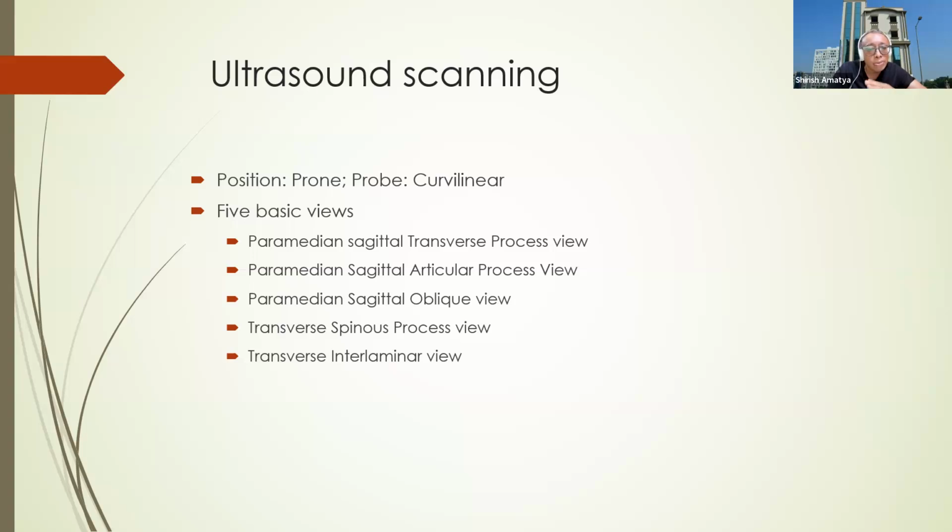In this paramedian sagittal oblique view, we can nicely see the anterior dural complex, the posterior dural complex, and we can also give epidural injection in this view. And 2 other views are transverse spinous process view and transverse interlaminar view.